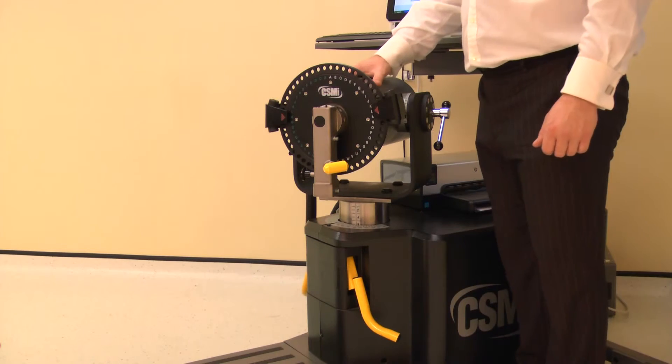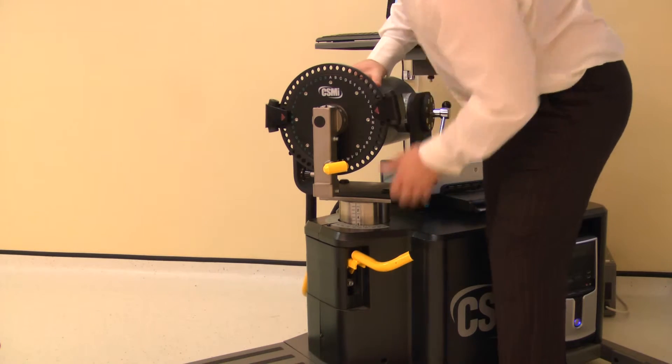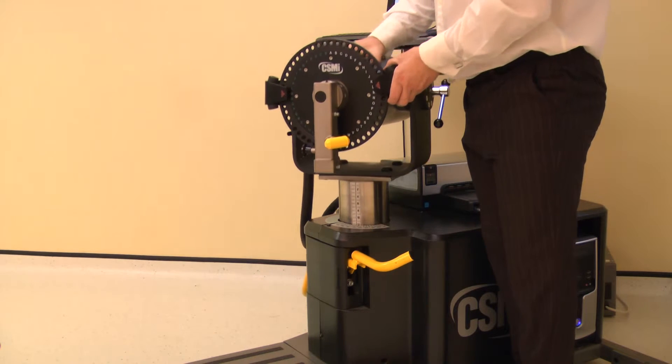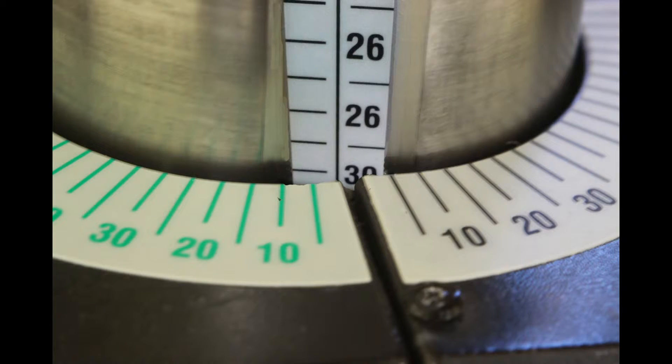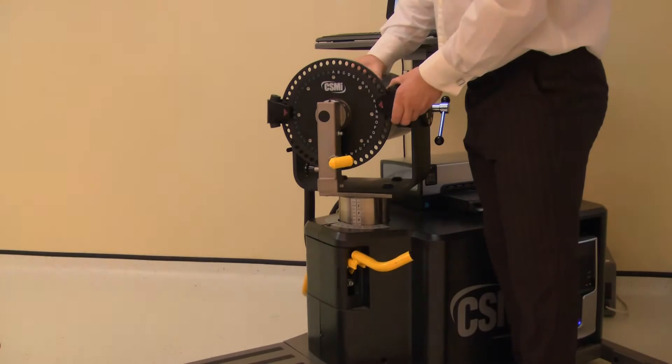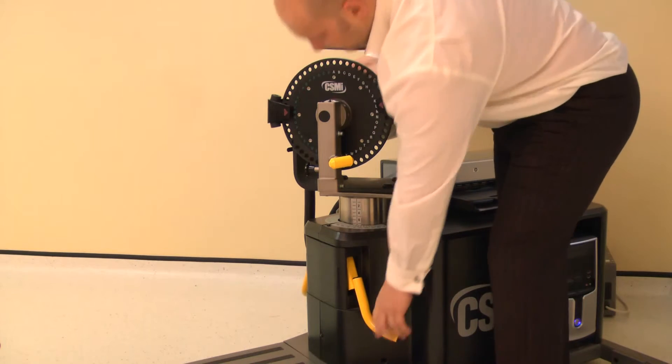The dynamometer height and rotation are adjusted together. Lift the locking handle to release. Rotate the dynamometer to 0 degrees, whilst also adjusting the height to 30. Ensure both locking handles are pushed down to secure.